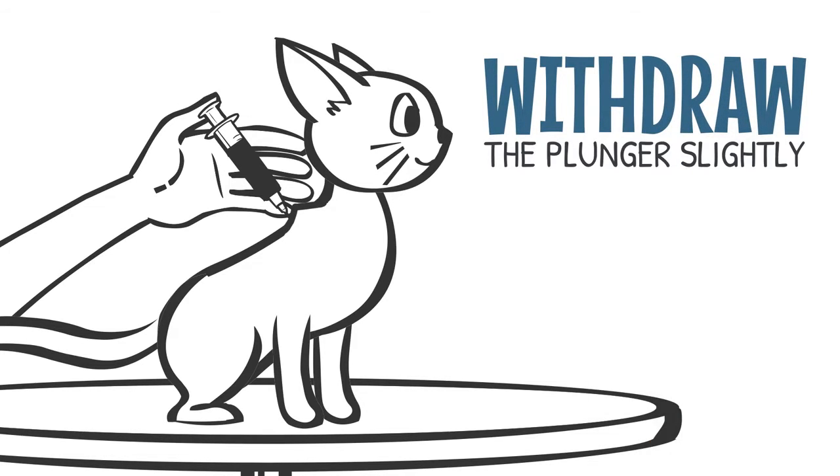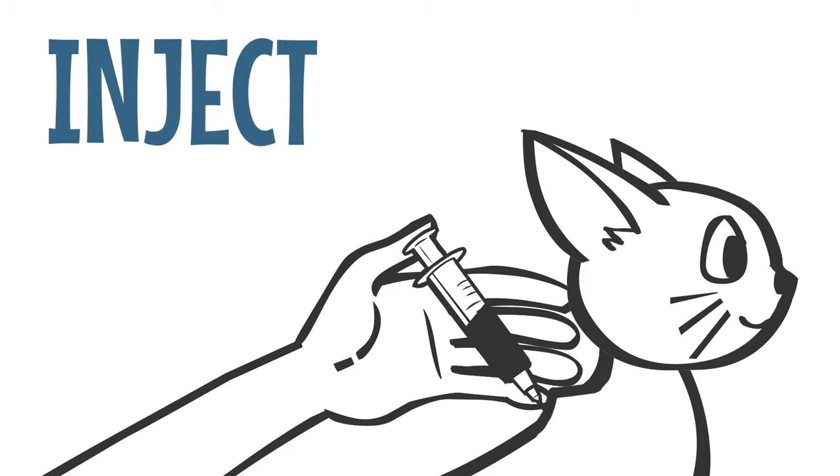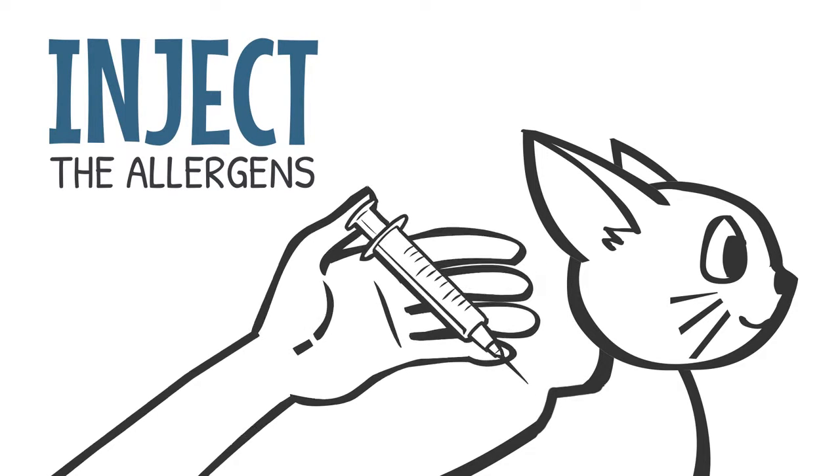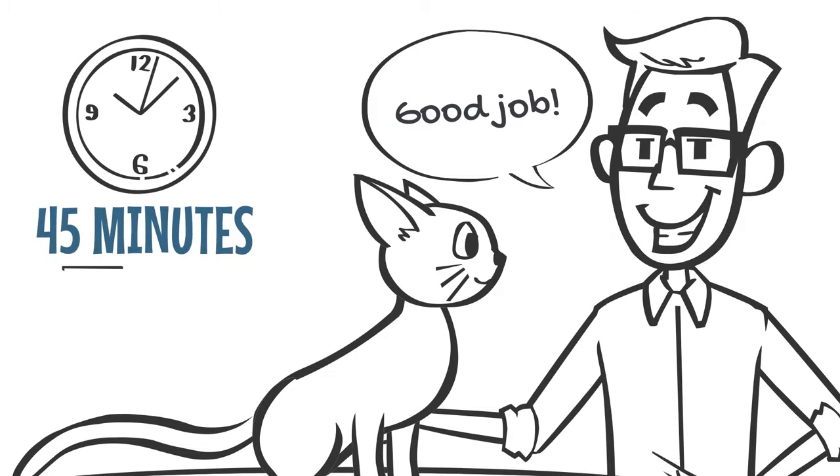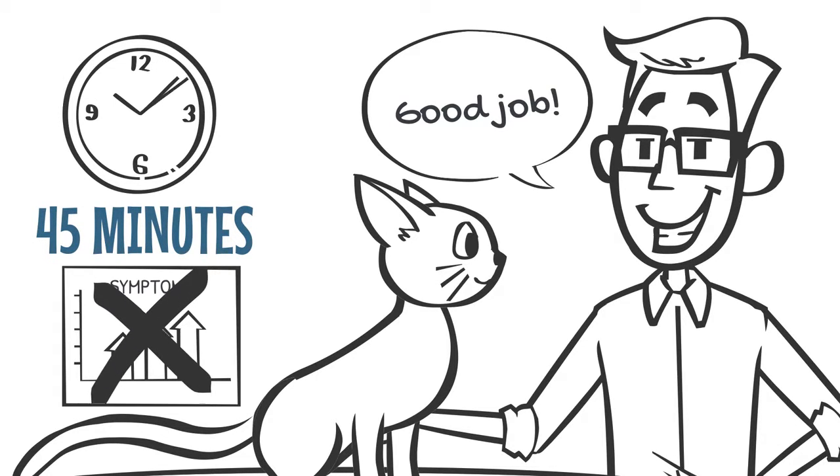Withdraw the plunger slightly. If no blood is present, inject the allergens and remove the needle. Massage the area, praising your pet, and observe them for 45 minutes, ensuring their symptoms don't increase.